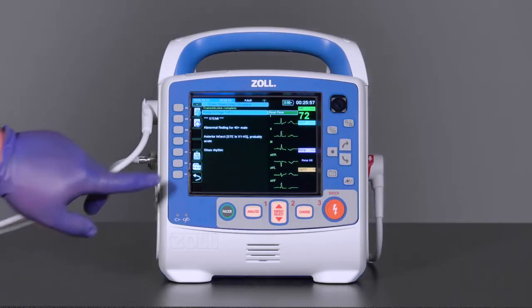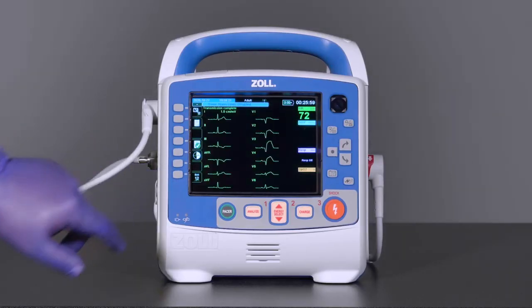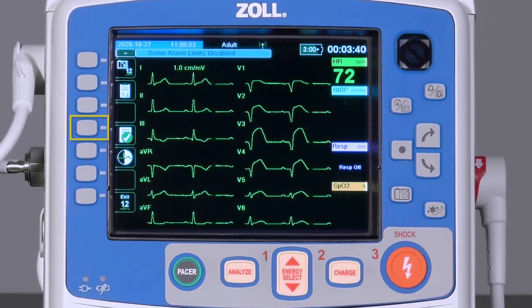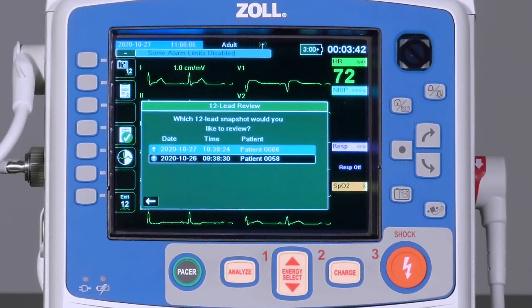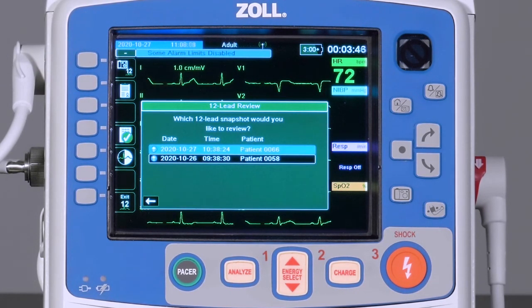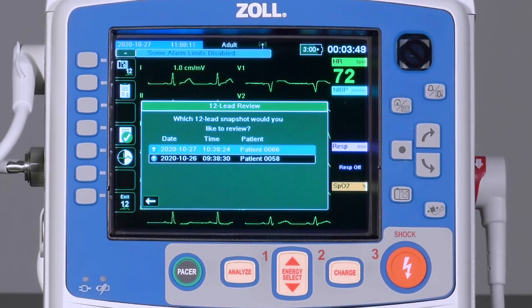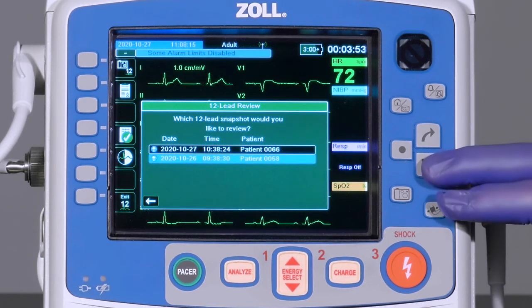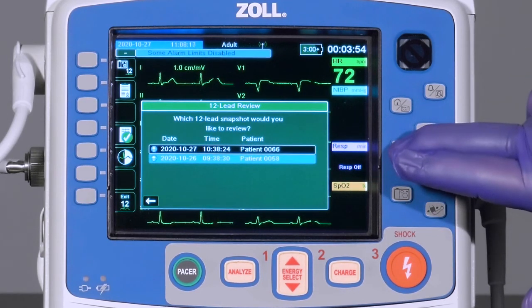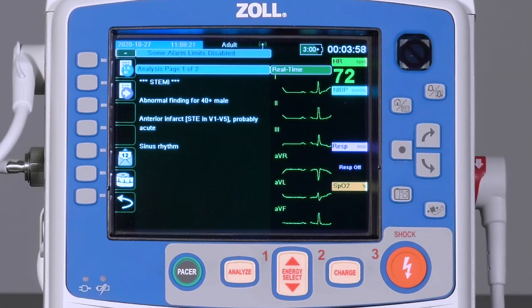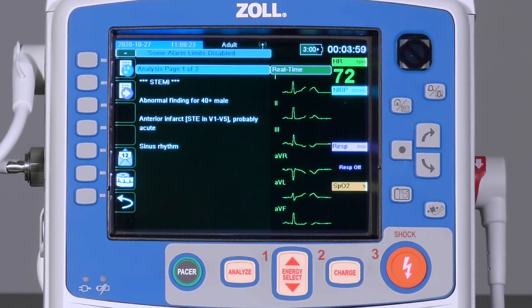Press the back key to return to the 12-lead menu and diagnostic 12-lead ECG screen. Press the 12-lead archive key to access a list of available 12-lead ECG snapshots in the device. The most recent will be the first entry in the list. Selecting one of the ECGs will return to the static dynamic view screen to review, print, or transmit that 12-lead ECG.